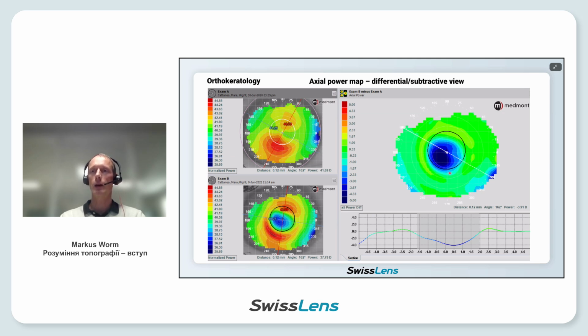On the left side above, you see the first measurement. On that base, the lens is constructed and produced. Examination B below is after the lens is worn. On the right side, you see the changes, the difference, examination B minus A. Here we use the axial power map that shows us the vision.